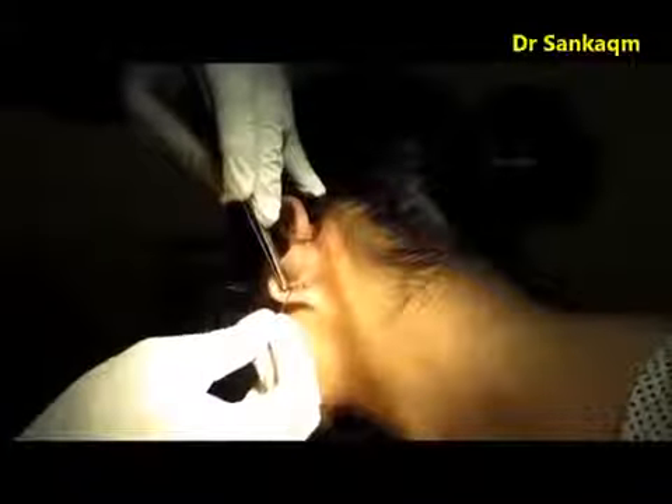So the rule is: one should remove the posterior surface stitches first while the anterior surface stitches are intact. After removing the posterior surface stitches, one can then remove the anterior layer stitches easily without any manipulation. This way there is less chance of dehiscence — that is the rule.